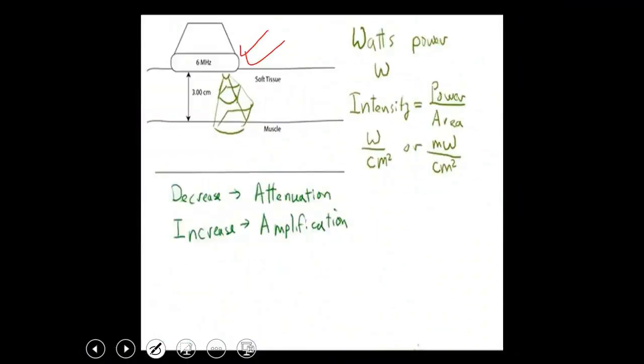The pulse will be sent, and this pulse will move through the tissue. After that, it will cross the border between the tissue and go to the next medium. While it is moving, there is an interaction between this pulse and the existing tissue. We will talk about these interactions, which involve loss of energy, leading to attenuation.